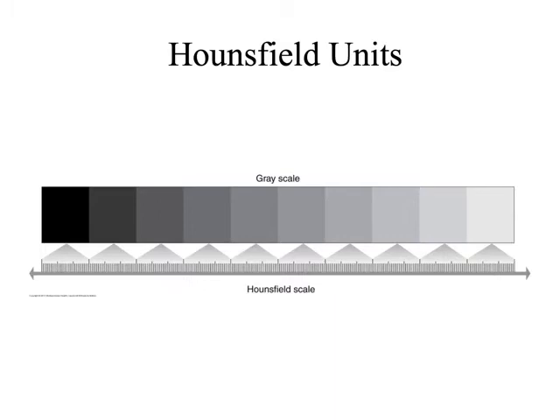Have y'all talked about photoelectric effect in physics yet? Okay. Or it might be reduced by Compton effect. If the X-ray beam interacts with the object and ionizes an atom, it could be reduced, and the reduction by that object is going to be called attenuation. So Hounsfield units are a way for the computer to quantify that attenuation, right?